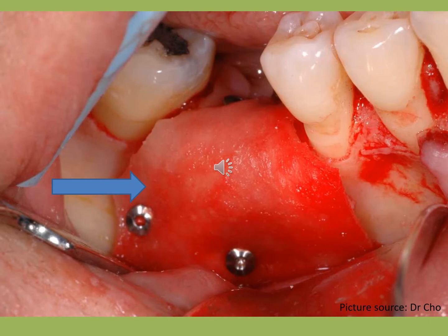Another picture of clinical application of membrane. There is bone graft under this membrane. This membrane is stabilized by using small tacks for prevention of the movement of the bone graft and membrane during the healing period.